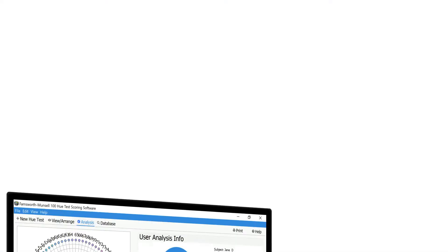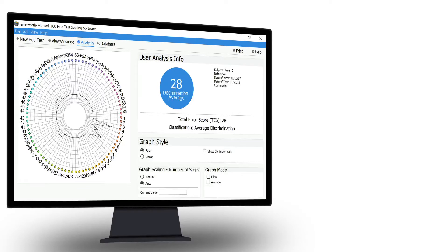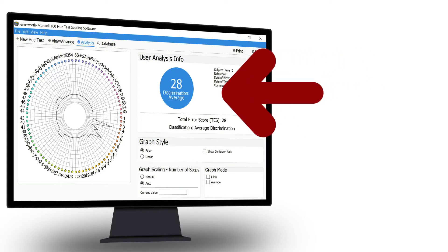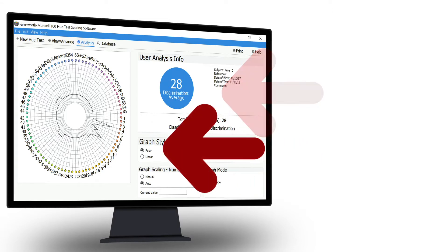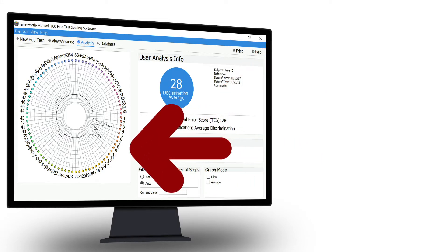The test results will reveal two things. First, for normal color vision, it reveals how well you discriminate different colors. Second, if you have a color vision defect, it identifies where your color confusion lies.